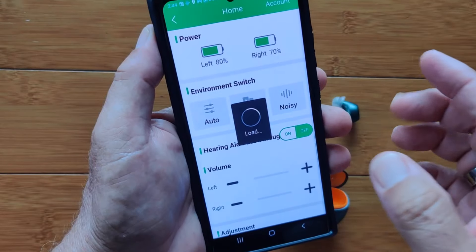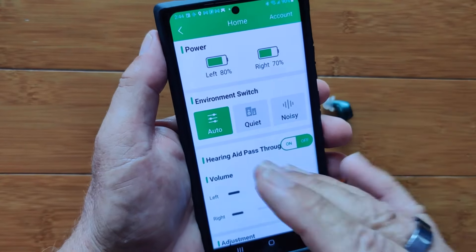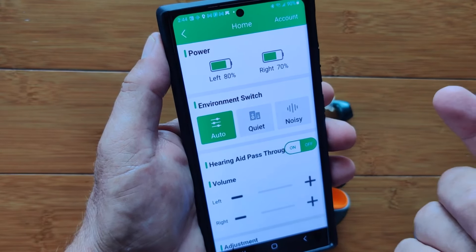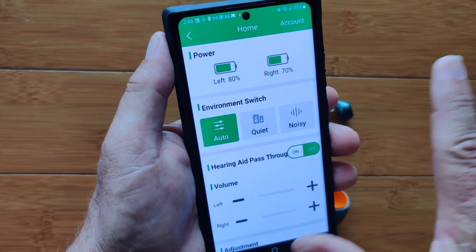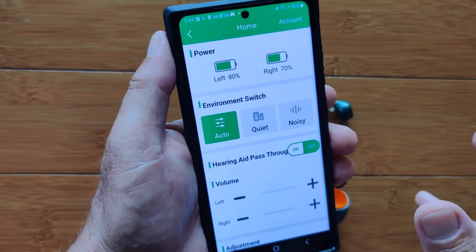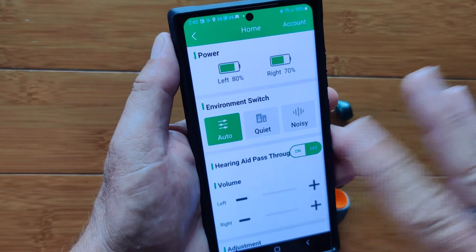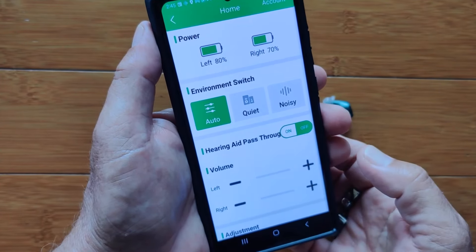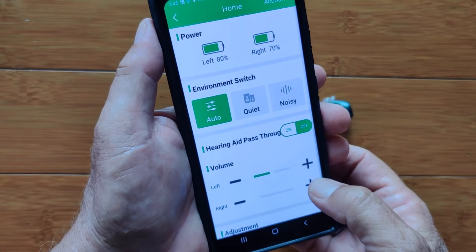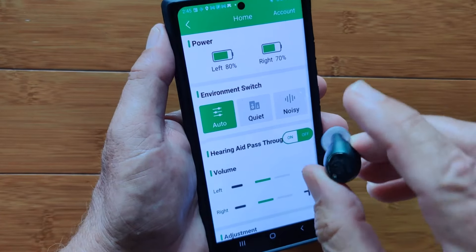That's your overall equalization contouring. Then you have environmental switches which are pretty dynamic. In 'quiet' mode, you can hear very soft sounds — like a water drop in the bathroom you didn't notice before. In 'noisy' mode, it dampens everything except voice so you can distinguish speech. On ambient listening, it doesn't affect music playing through your device. 'Auto' is a good setting — it contours and adjusts when the environment is noisy or quiet to give you the best balance. You have volume control settings you can change, and hearing aid pass-through which just lets sounds pass straight through. You cannot change the volume directly on the earbuds.